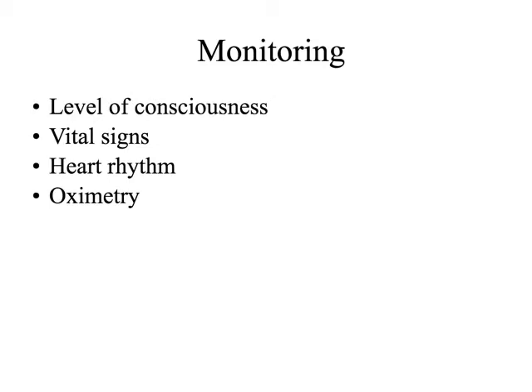Because that way you have a baseline blood pressure before I give them any contrast. So if they do have a reaction, when I call the code, I can say before I gave them the contrast, this was their blood pressure. Has it fallen off? Yes, they're going into shock. Right? So baseline blood pressure is pretty easy. We've got robots that can do it. So once I've got the patient on the table, I've got the IV in one arm, I can put the blood pressure cuff on the other arm and get a quick blood pressure while I'm doing my initial scout scans.